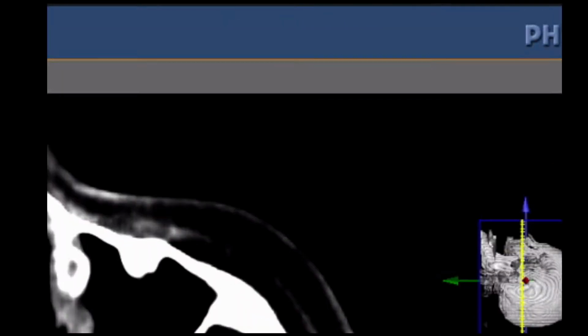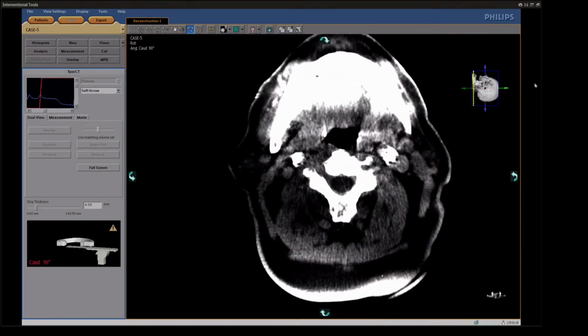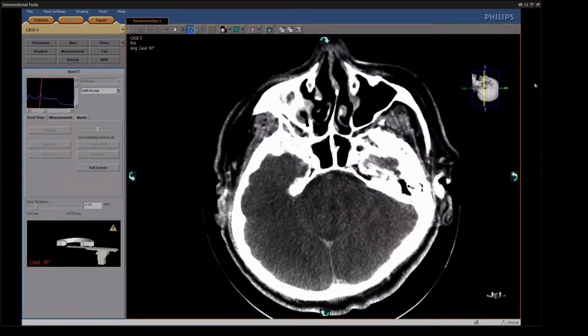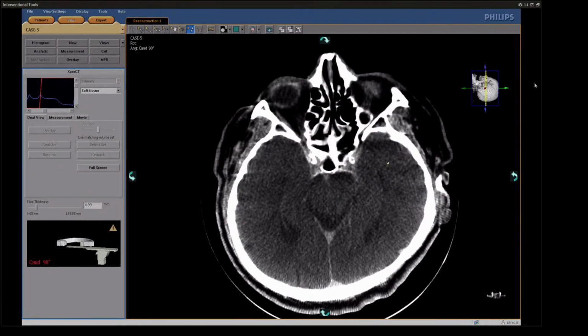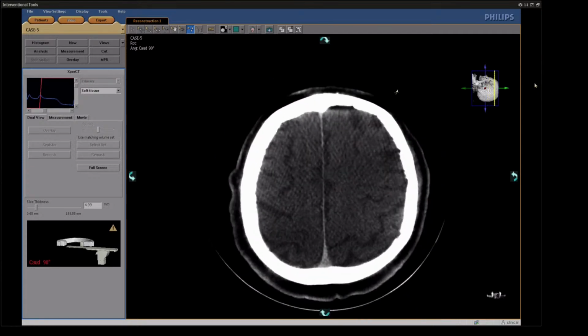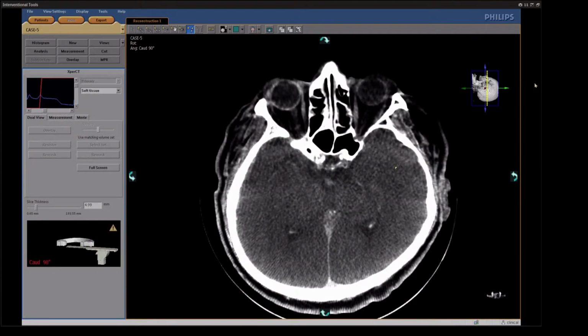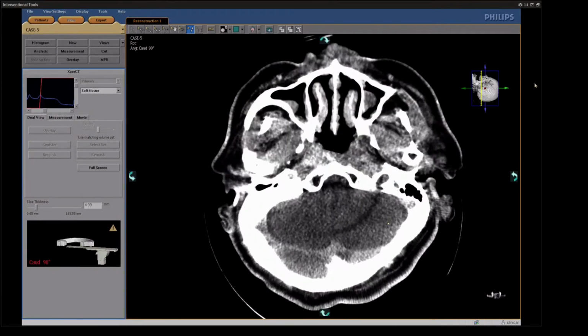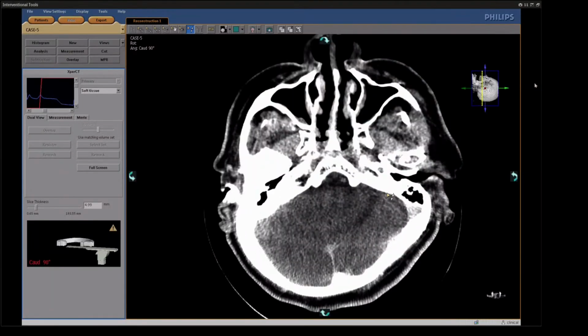Dear colleagues, the expertity is ready. This is carotid side and intracranial side. Both carotid stents and the brain are clear. Looks no problem. Now we can finish the case, and we have one more patient with the ICA aneurysm. See you in next 20 minutes. Thank you.